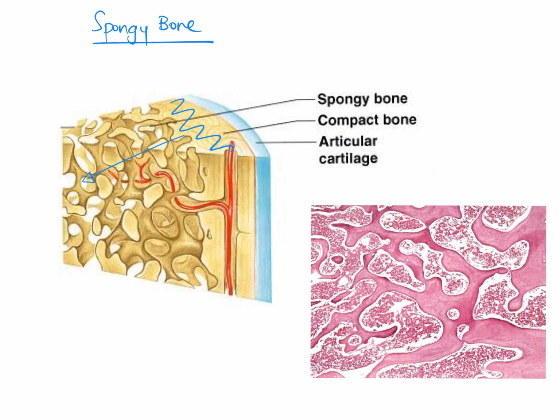So histologically, you can see that this image looks quite different to the one that we saw in the previous slide, and keep in mind that this is a low magnification. There are still osteoblasts, osteoclasts, and osteocytes present here, but you can see there is a lot of marrow present around. What's the one thing that we don't see in the structure of spongy bone, Vidya?